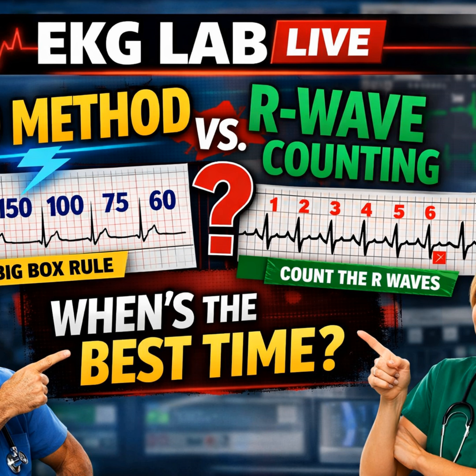That's a strong point, but I interpret that bias study differently. It also talks about premature closure. Locking in on an answer too early. Right. My concern is that the big box method is premature closure. You pick 2 beats, you calculate the rate, you write it down, you feel good because you did math, and then you stop looking. And you think the strip method keeps the eyes open.